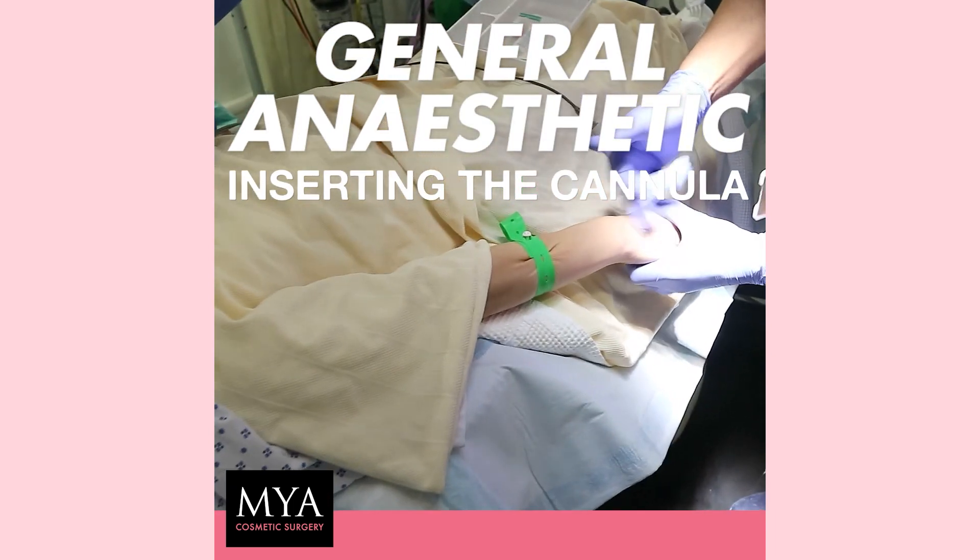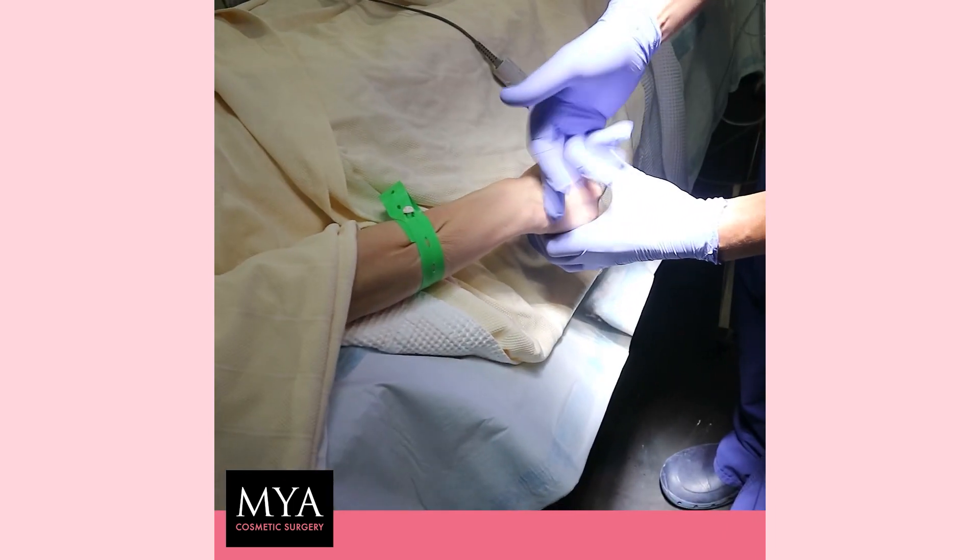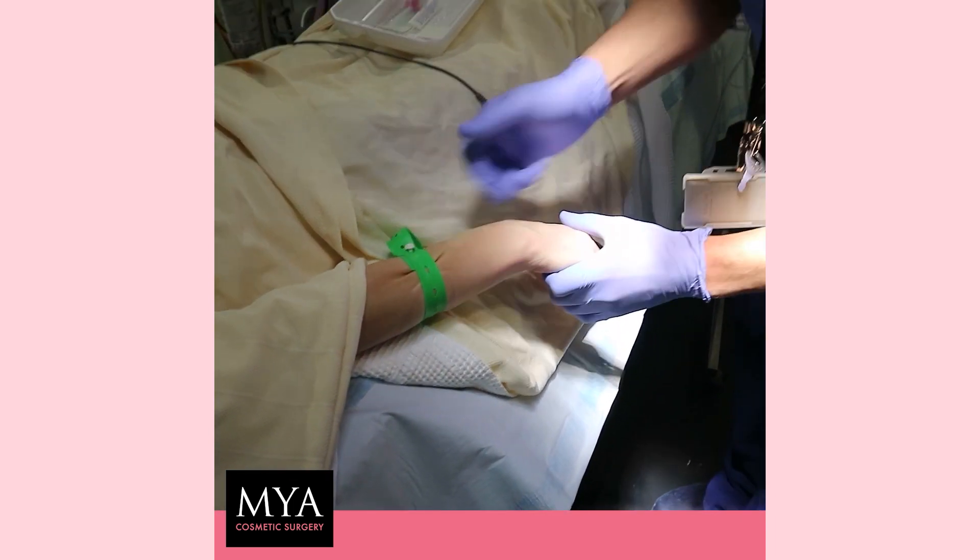Squeeze your arm a little bit. Yeah, thank you. That's it. Just relax your hand for me. Thank you.